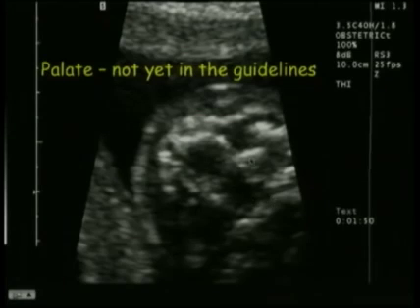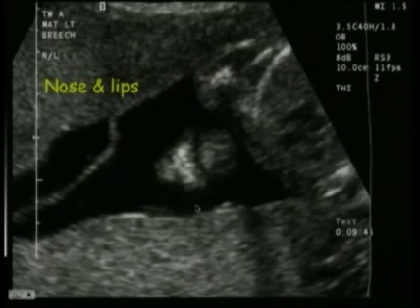The palate is not yet in the guidelines, but it is something we do at the University of California on everyone, and this is the palate with the primary palate here and the secondary palate posteriorly and in the back. The lips, as we said earlier, have been added to the guideline. This is the upper lip, and you can see the 2 nostrils right here of the nose. This would be the lower lip.